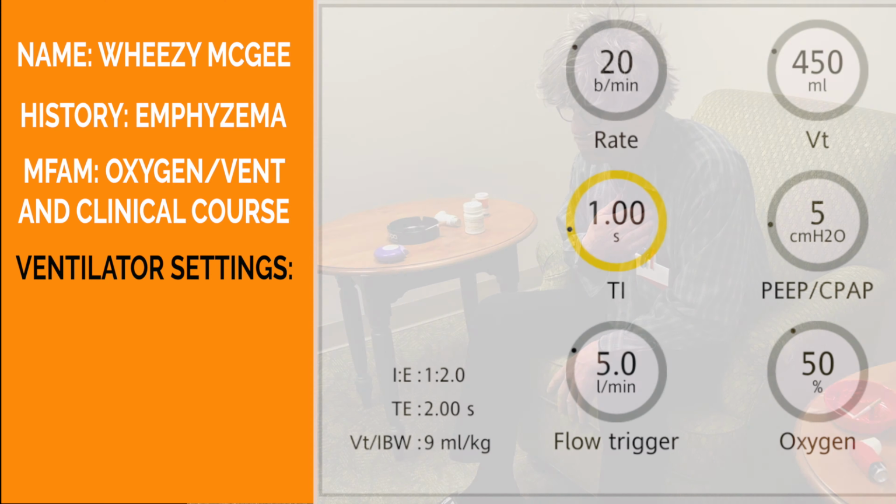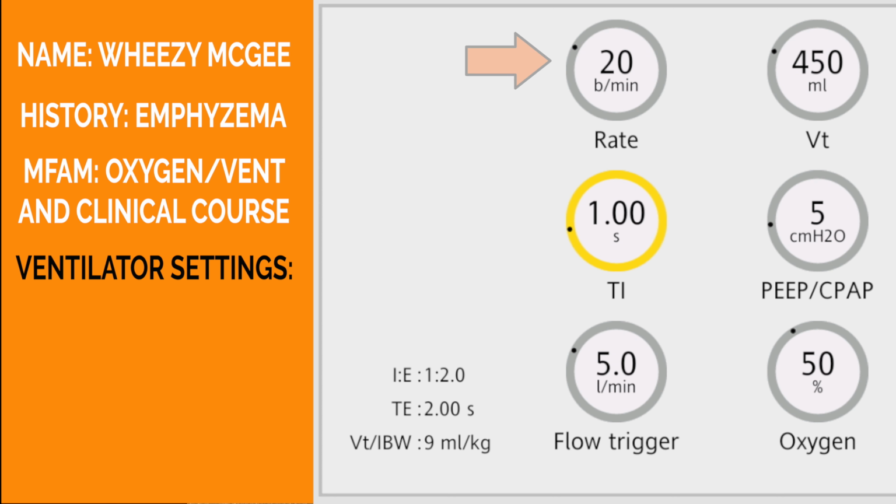Here are his initial ventilator settings. Initially, he has a frequency of 20 and an inspiratory time of 1 second, yielding an inspiratory to expiratory ratio of 1:2. Poor obstructed Wheezy only has 2 seconds to eliminate 450 milliliters passively.